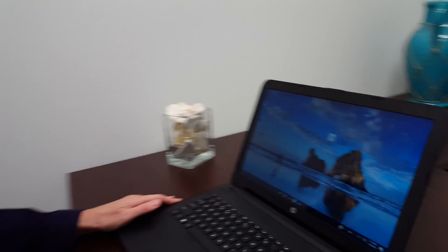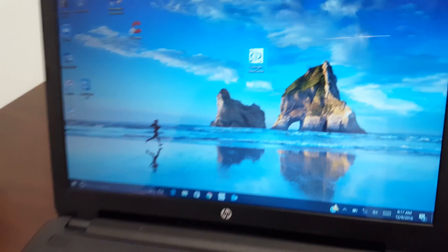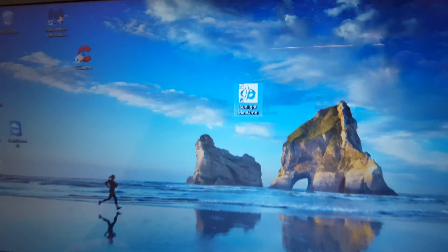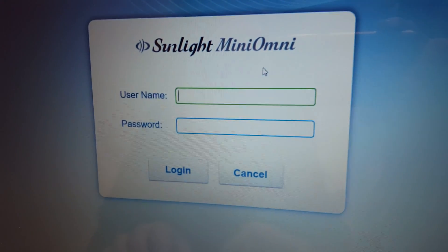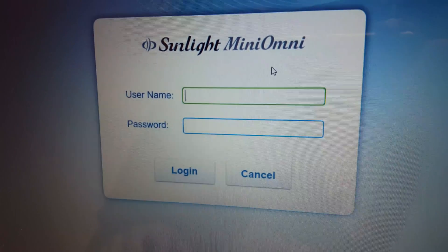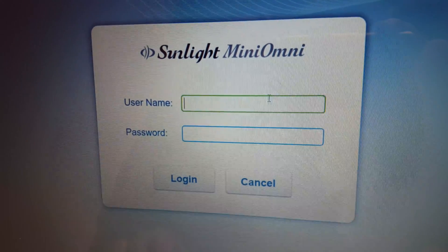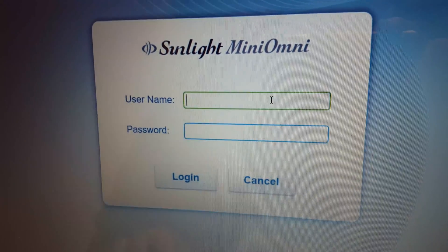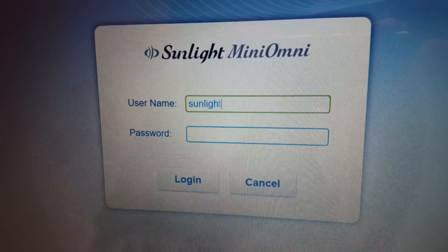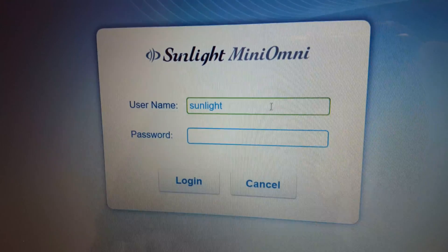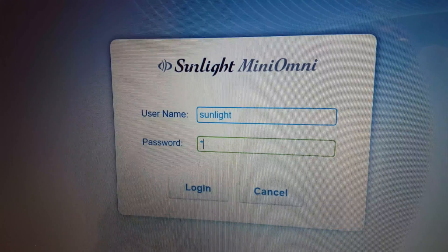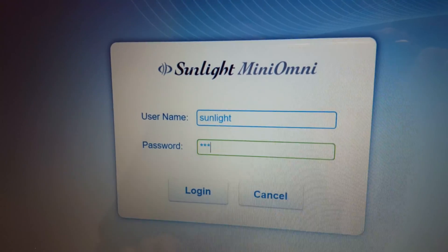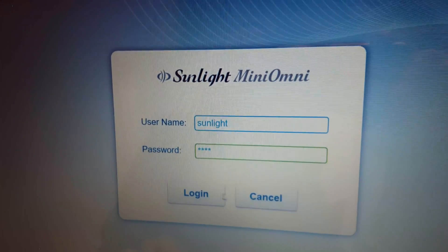You'll want to go into your Sunlight Mini Omni software and double-click. The welcome screen will show the username is Sunlight and the password is lowercase omni, O-M-N-I lowercase.